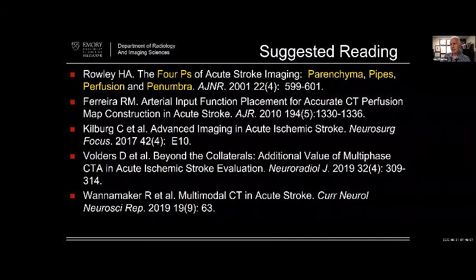If you have head CT only, hemorrhage should evolve in terms of its density. And of course, I'm big on anticipation of trying to figure out what it should look like. When you're reporting or talking to people on the phone, try to remember what it was like to be the intern you used to be, and try to help that intern. Try to figure out what could be helpful and where people might misunderstand or misinterpret things.